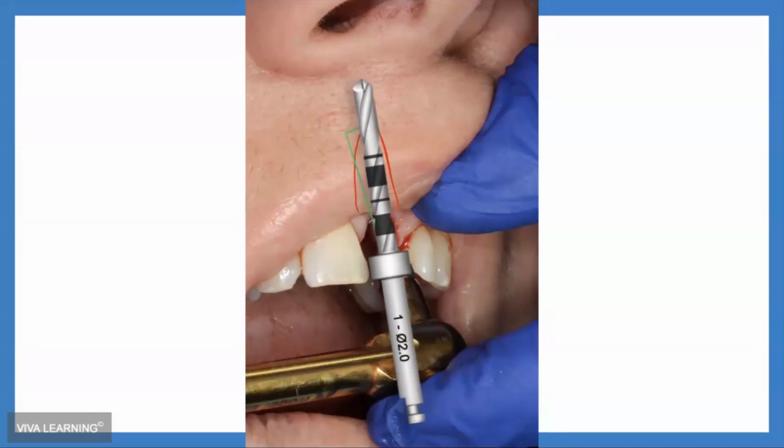And what you end up with is not the angle that you planned. I know surgeons are well aware of this, and they place freehand, and they're very talented. But general dentists, we're under the assumption that if we use a guide, this is not happening. But this is definitely happening when you use a guide.